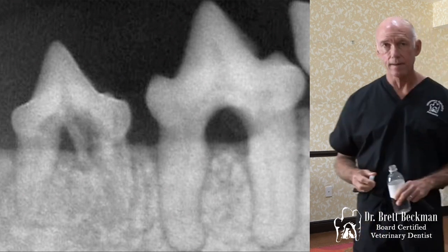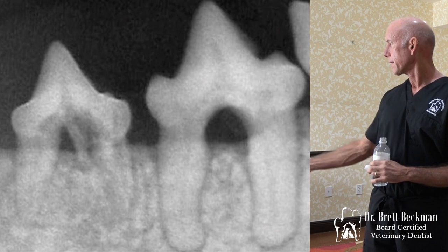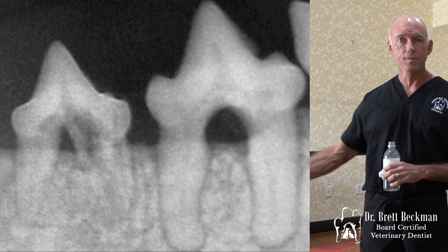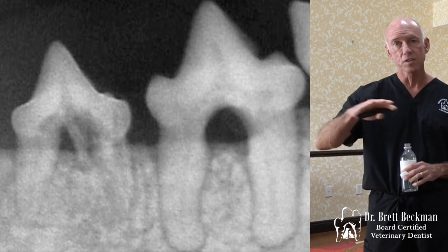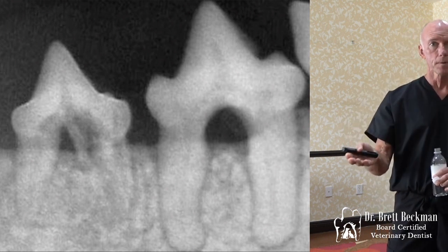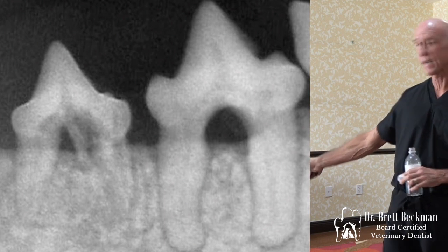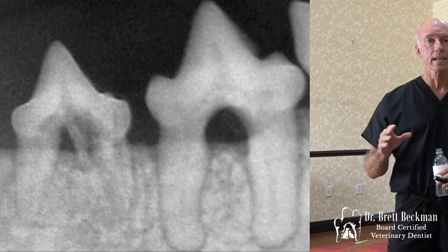So you want to be able to look at that on radiographs like you see there and say, oh, okay, this looks like a lucency all through here. Before I even go in there, I'm thinking I'm going to remove that with my diamond football burr. And then once that's smooth, you look at it and it should all be smooth. You may still be able to see the outline of the tooth, but there's no pulp, there's no line of demarcation that's significant there, because you can't see it radiographically, you're not going to see it grossly, and then you're done. It's just a quick and easy decision.